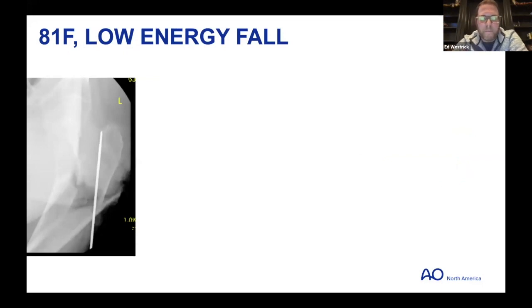But just jumping back to our elderly patient, we'll just call these 1 and 1A. They're very, very similar. Again, this is the elderly patient, and this is a trick that I find helpful for this situation. In my mind, the piriformis fossa start point is most appropriate for this patient to prevent varus deformity and help us achieve the alignment that we want.